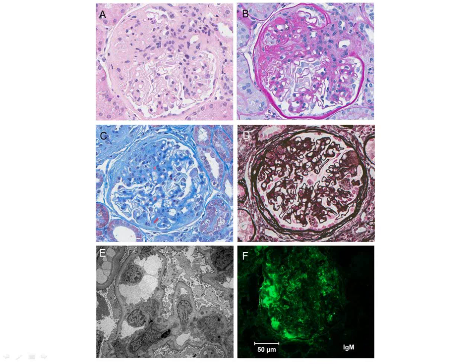So if we think about right up here, we've got this hyaline here. These are not the same glomeruli, obviously. This one's histology, this one's IF. But we have hyaline insudation into the segmentally scarred segment. This is trapping all of that, and that's why you're seeing this splotchy appearance. So it's not just saying, yes, it's positive, it's 4+ positive. It's 4+, and the pattern is that of splotchiness, which means it's nonspecific. If it were specific, we would see granularity. And we don't have any granularity on this glomerulus.